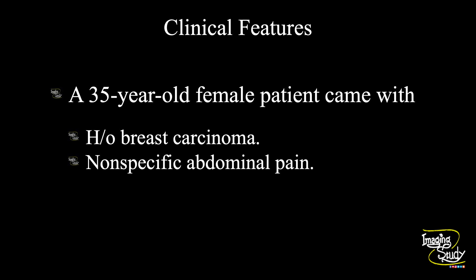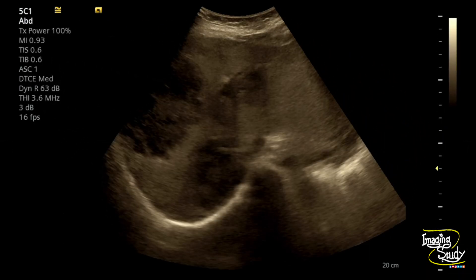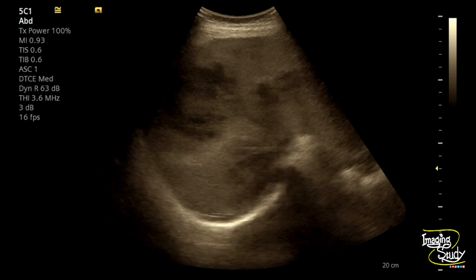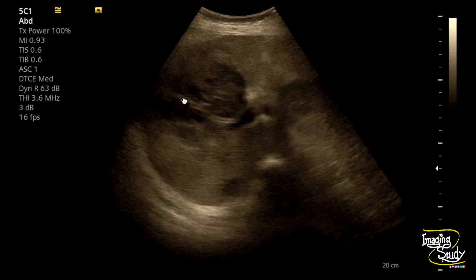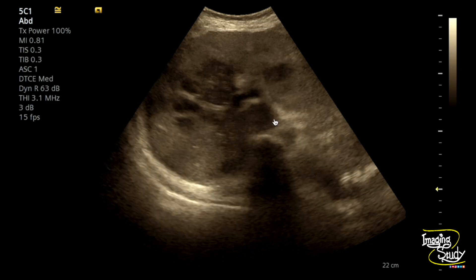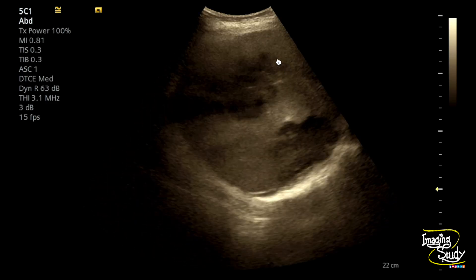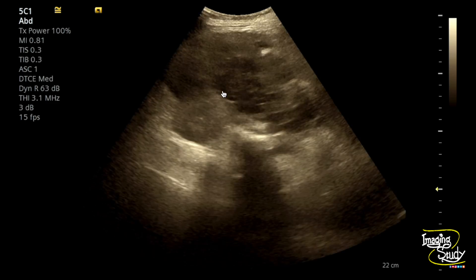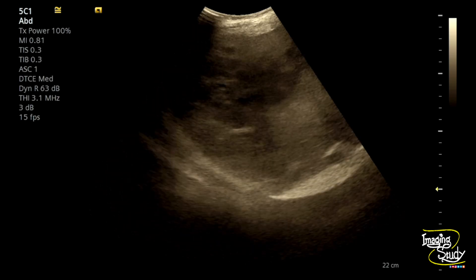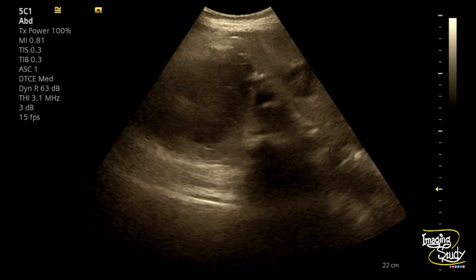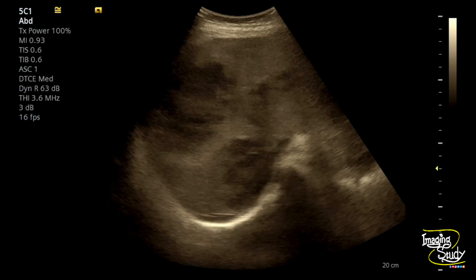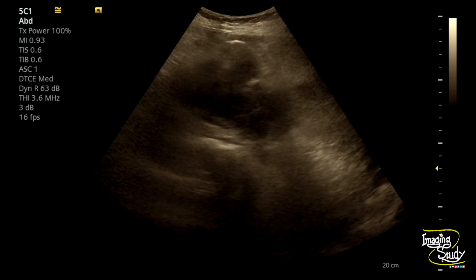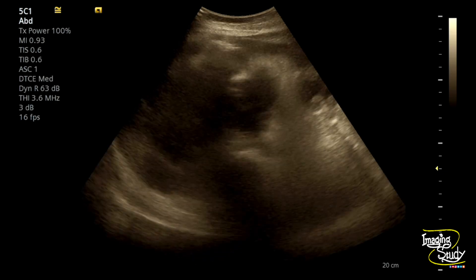Let's see what we have got on ultrasound. Here we have started with the liver. You can see multiple irregular heterogeneously hypoechoic mass lesions throughout the liver. These lesions are seen in almost all segments of the liver. When there is a history of primary carcinoma and you see multiple space-occupying lesions throughout the liver, it should be a case of hepatic metastasis.